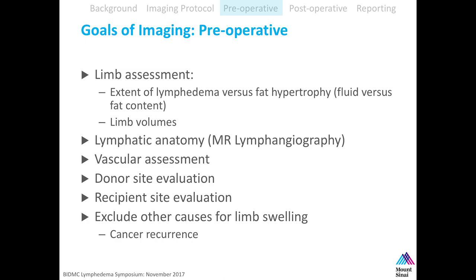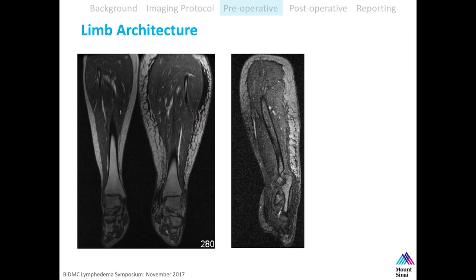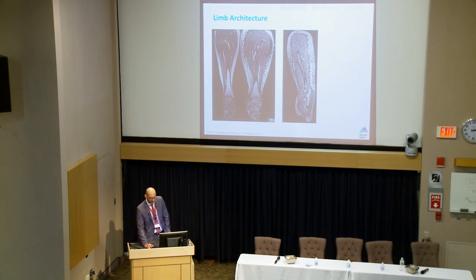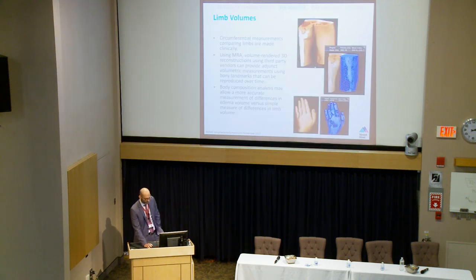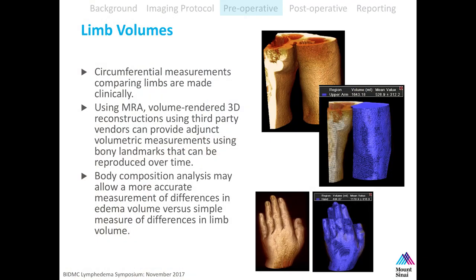The worst call I have to make is calling my surgeons to tell them I see something worrisome as a cause for limb swelling. Looking at limb architecture, here's a lower extremity where the unaffected side has normal fat signal on T1-weighted, fluid-dark, fat-bright images. In the affected extremity, you can see almost a river of fluid laterally. Here's an upper extremity with the same imaging approach. These are very thin isotropic voxels that you can upload to a third-party software program to automatically calculate volumes.